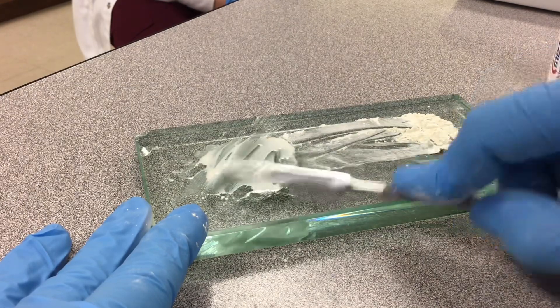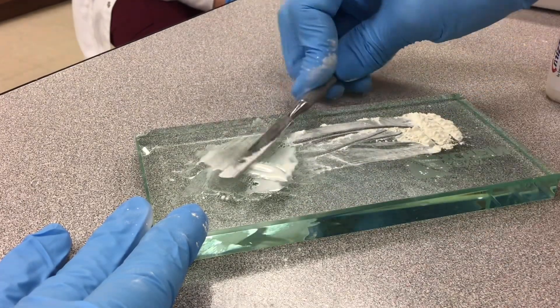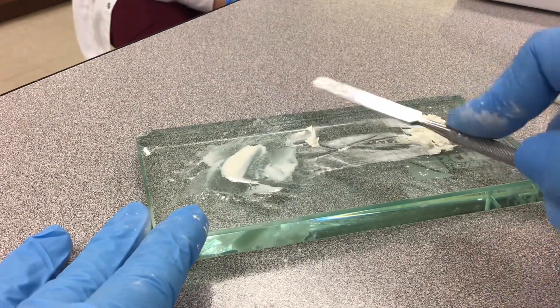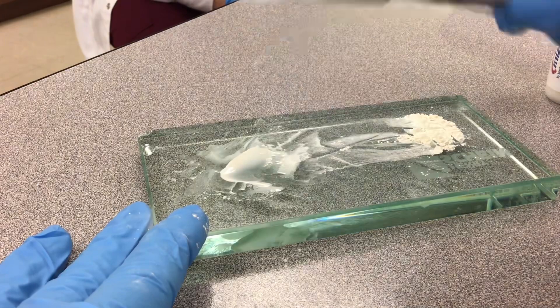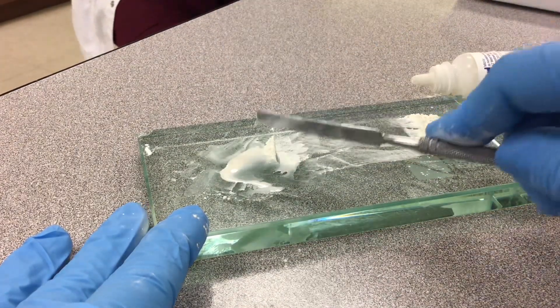Now this puts off a lot of heat. That's why it's important to put a little bit at a time, and it should be on a cold slab. And this actually is looking good because we are using this as a cement. It kind of looks more like a milky state, but still needs a little bit more because we need to thicken it up a little tiny more.